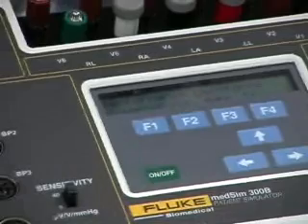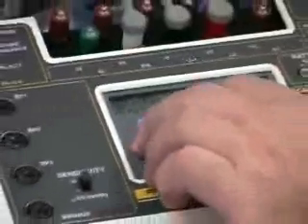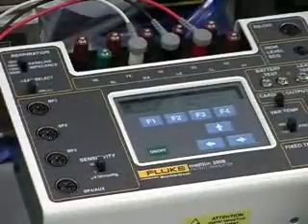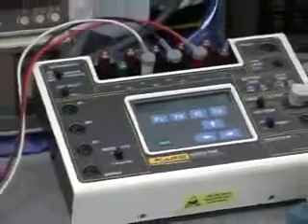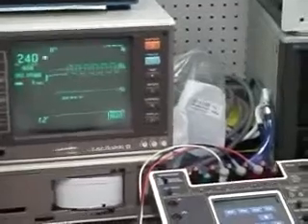We also have a DC pulse, where it simply outputs a 1 millivolt amplitude square wave for doing a basic low frequency test. And then also this different square wave for doing a gain test.